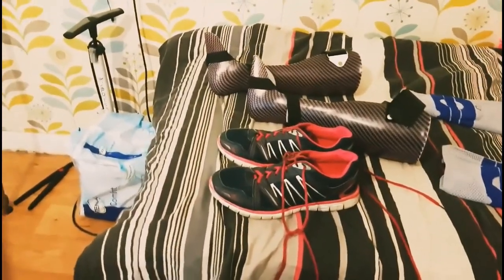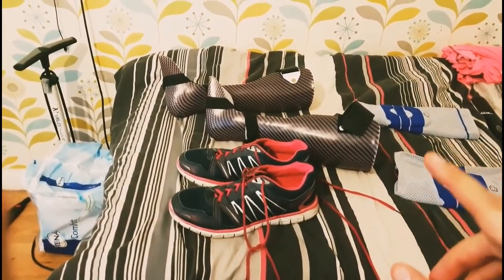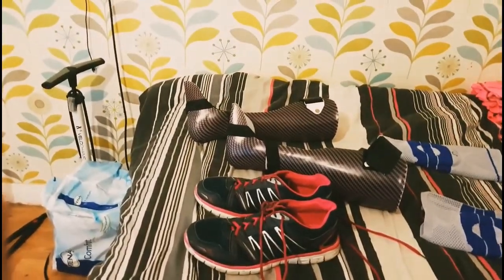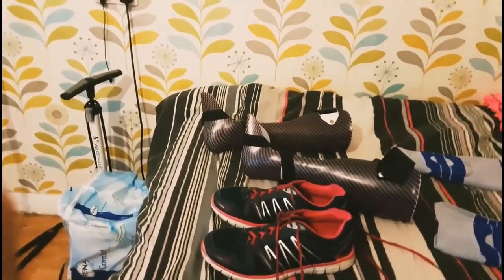Sorry, nearly sliding out of my wheelchair there. Because these cause my ankles not to move, I need help. That's basically one of the reasons why I need the wheelchair.